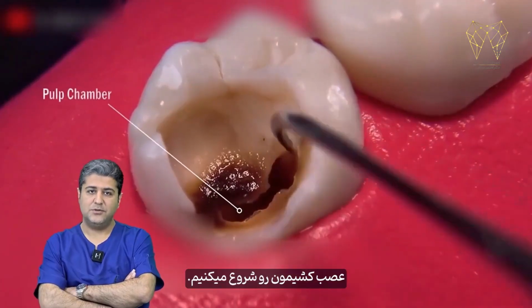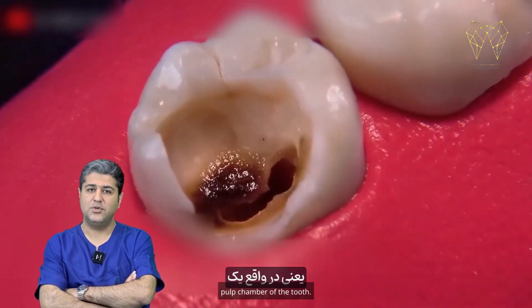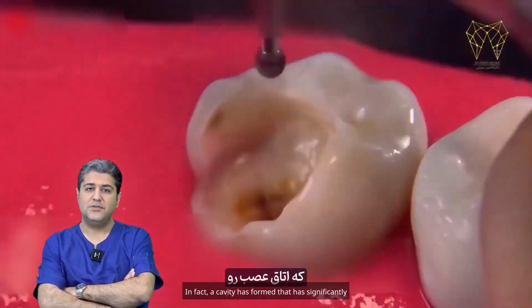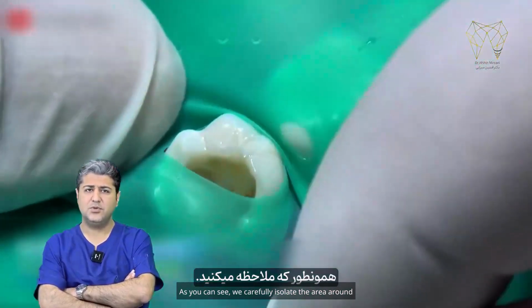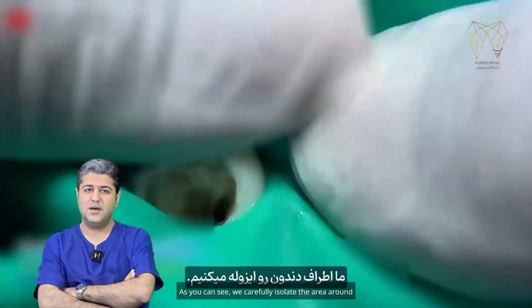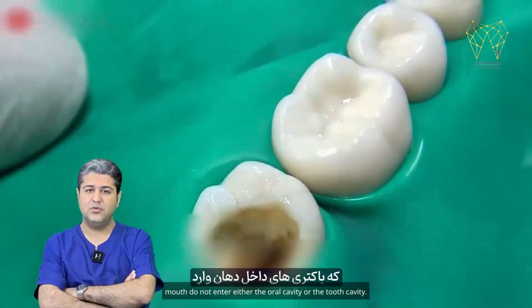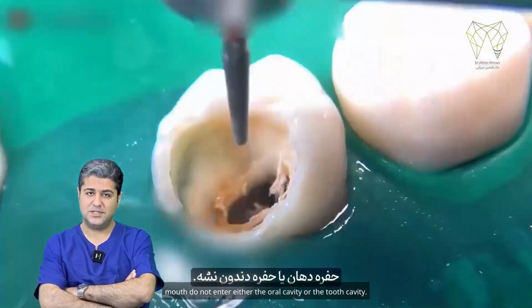canal treatment. Now, look here, we've successfully managed to reach the pulp chamber of the tooth. In fact, a cavity has formed that has significantly affected the pulp chamber itself. As you can see, we carefully isolate the area around the affected tooth so that the bacteria inside the mouth do not enter either the oral cavity or the tooth cavity.